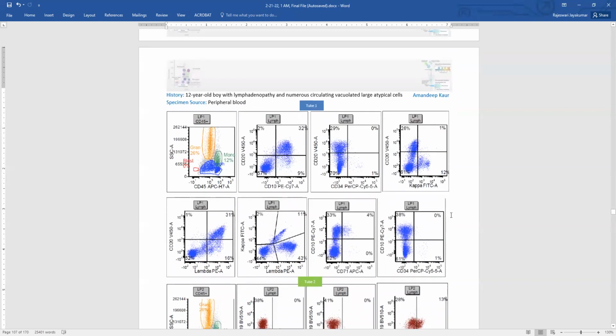And one more thing you have to remember is Burkitt lymphomas are negative for BCL2. Some labs perform BCL2 by flow cytometry. We don't have that here, but if it is added in the panel, it will usually be negative. So that also helps in the diagnosis of Burkitt lymphoma, and you can add that in your report. So this is a CD10 positive mature B-cell lymphoma that turned out to be Burkitt lymphoma.